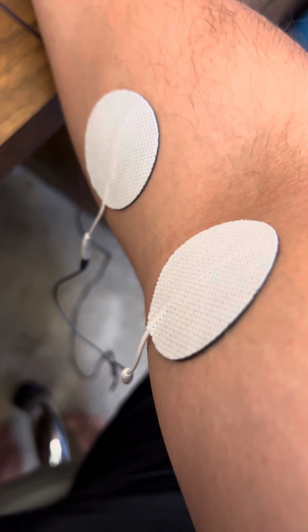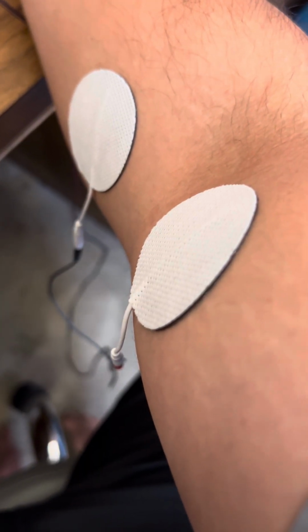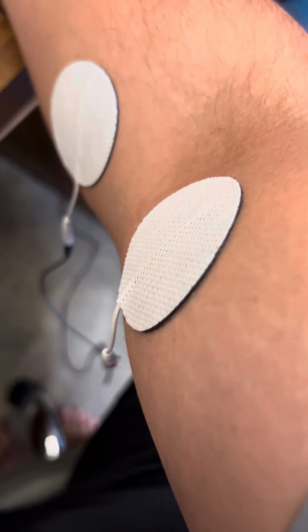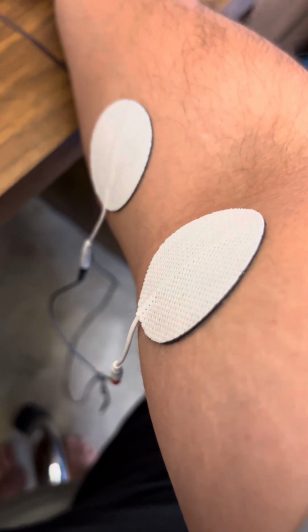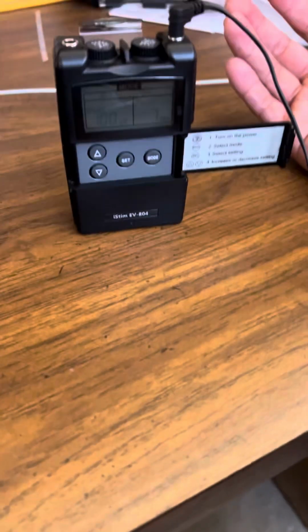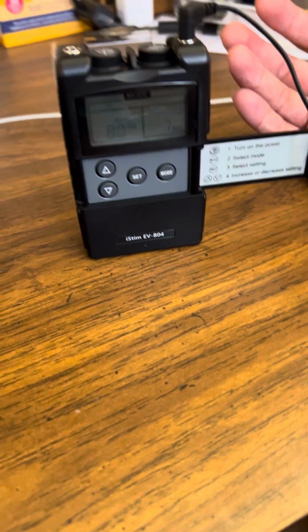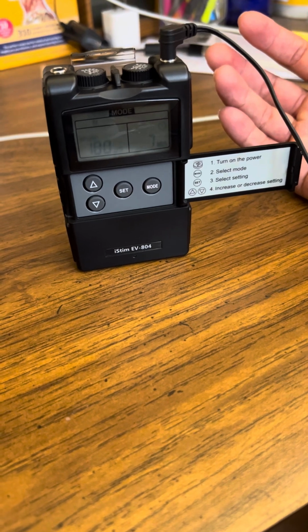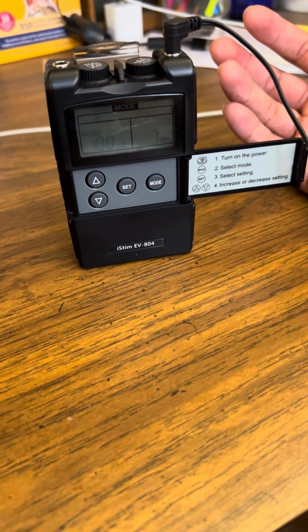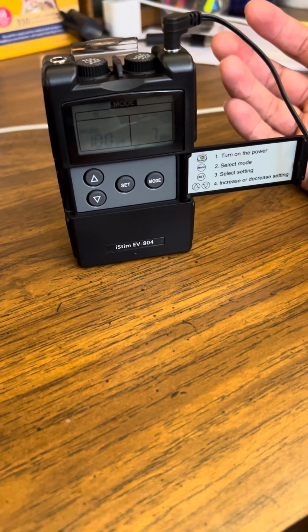And again, this only works when the device is on, right? So as soon as you turn off, the pain symptoms might come back for the patient, right? But yeah, so that's the TENS unit. And this is my home one that I have here at school. It's slightly different, but pretty much the same thing for TENS. And yeah.